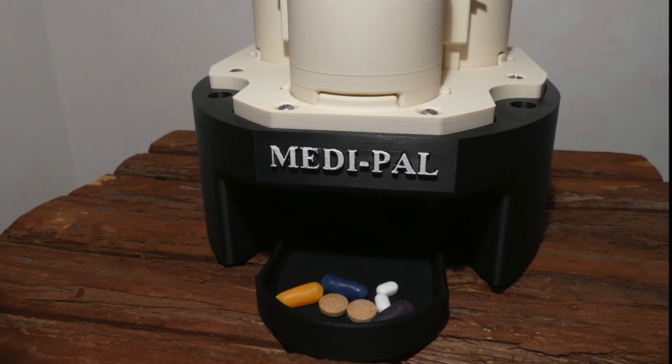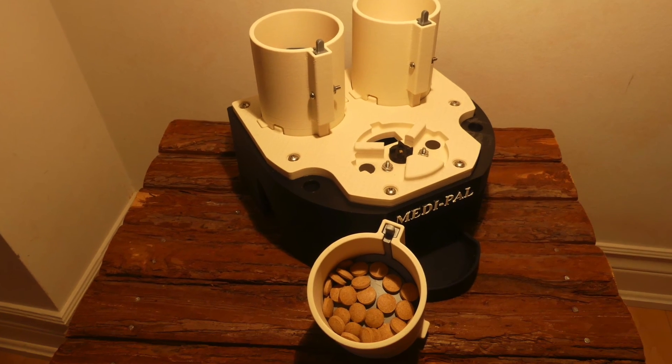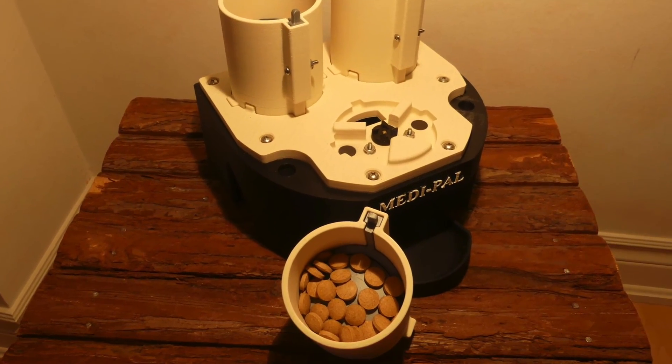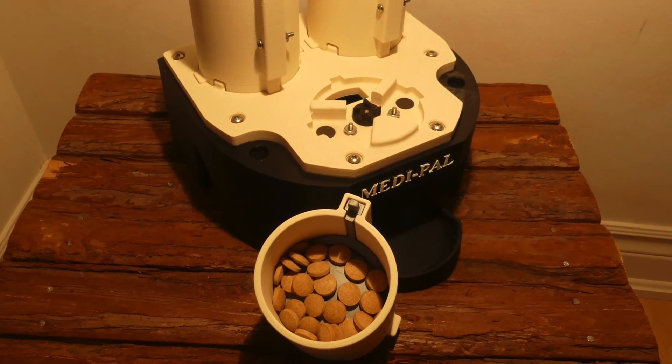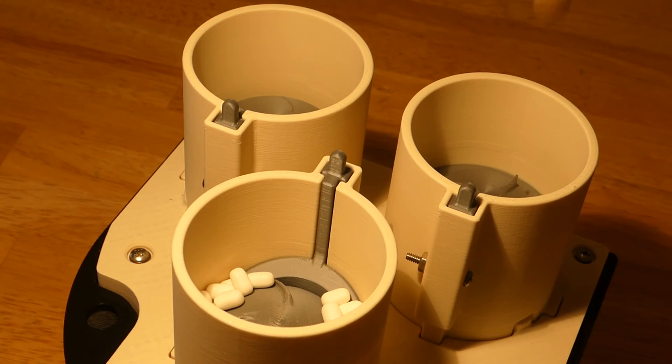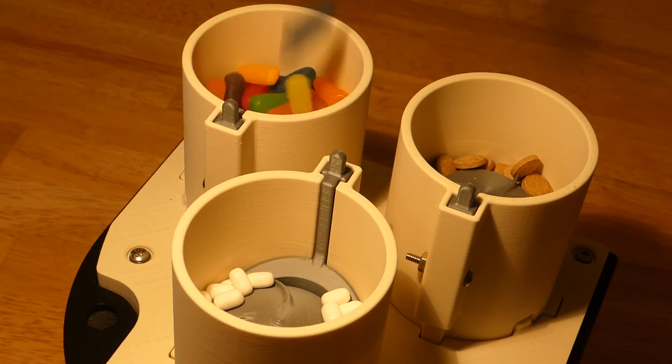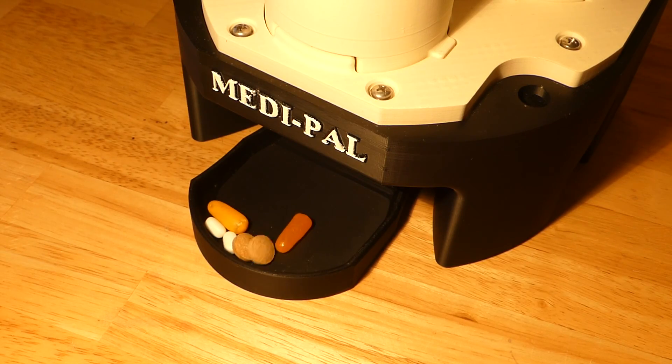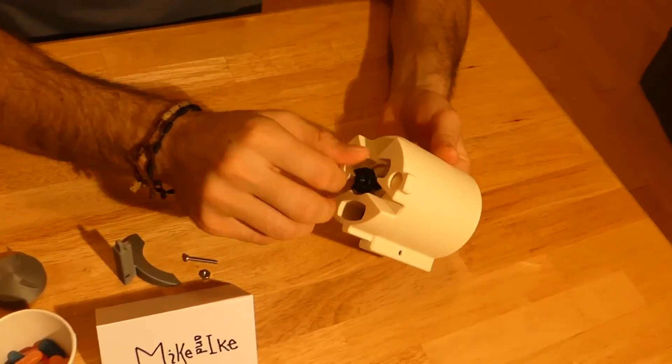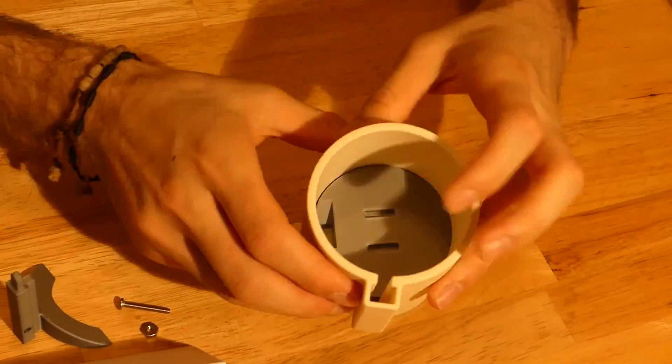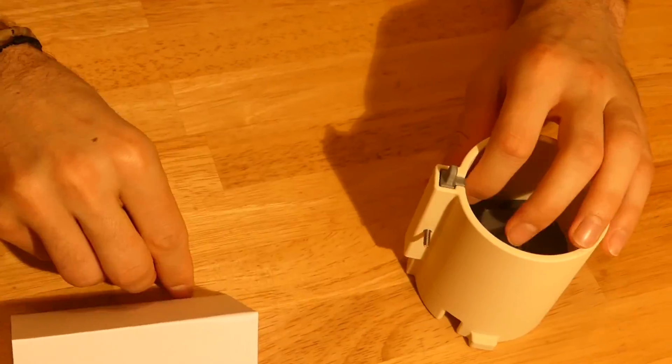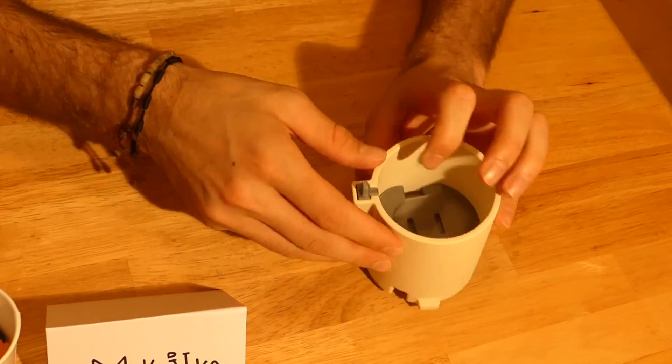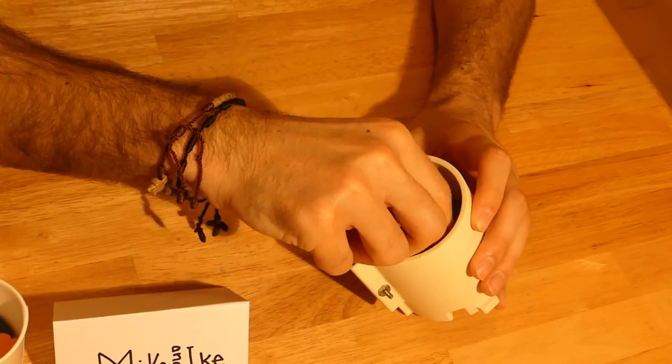The Medi-Pal was designed with the intention of optimizing the user's experience and safety by ensuring they take the right medication at the right time. Its modular design also allows for easy production and assembly.